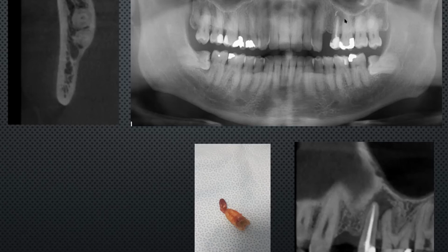I think that it's the safer way to do it, because if you do end up needing to do a little bit of grafting, then if you've got a flap, you have a lot more flexibility. And 99% of the time, my implants are 2-stage implants, so I will bury the implant. Because for me that increases the predictability, and it's my level of comfort. And so I would tend to do that rather than a flapless operation, or doing it by punching using a tissue punch, for example.